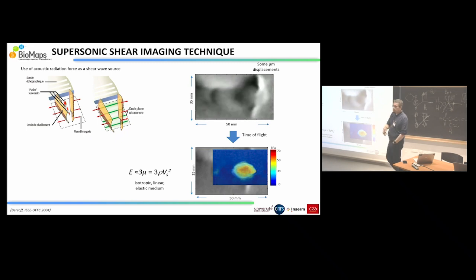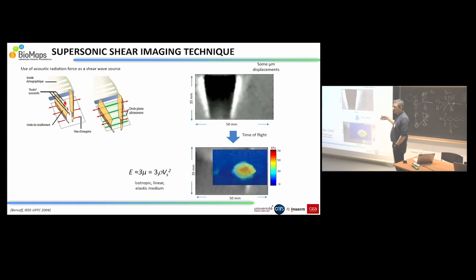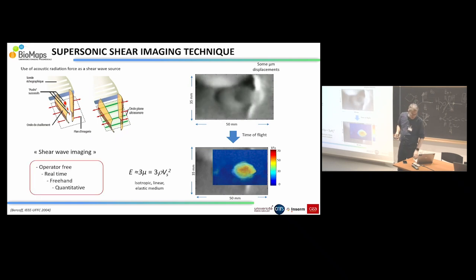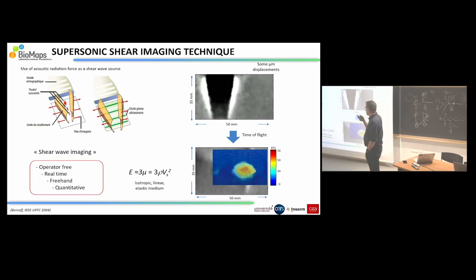So when it's blue, it's soft. When it's hard, it's red. And it's quantified in kilopascals, so you have quantifying information for medical application. So this is really useful for physicians because it's operator-free. You don't need to generate the shear wave. It's done directly by the system.